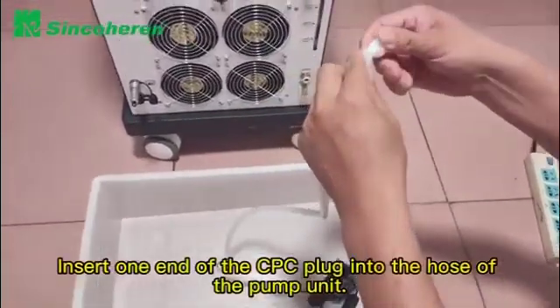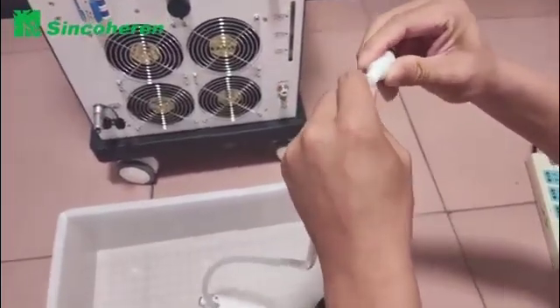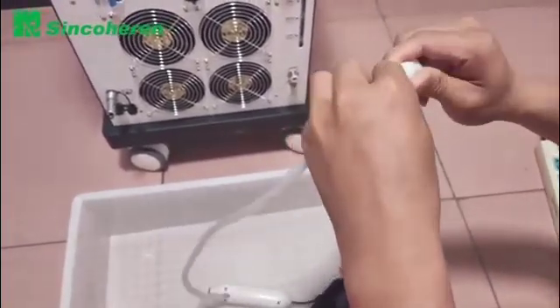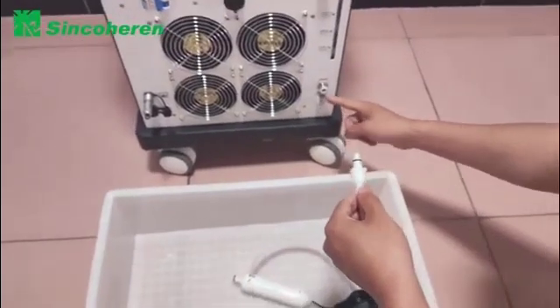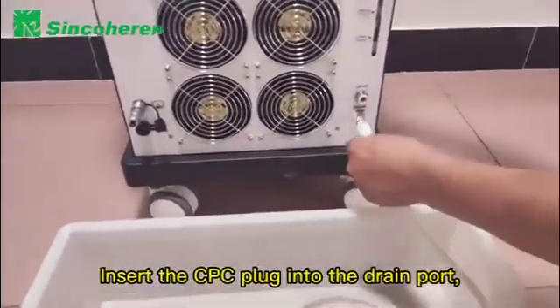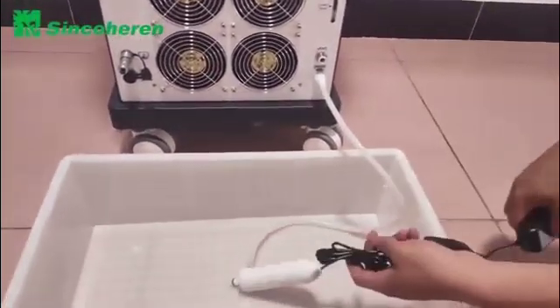Connect one end of the CPC plug into the hose of the pump unit. Insert the CPC plug into the drain port, then turn on the power switch to drain. Take care.